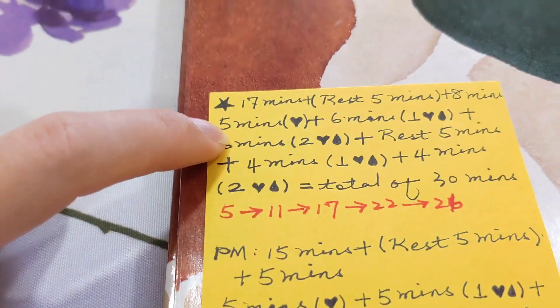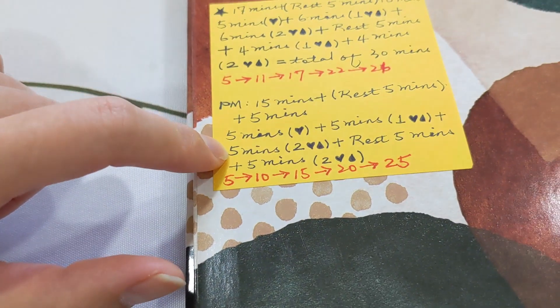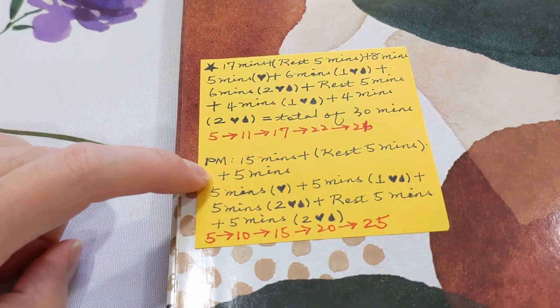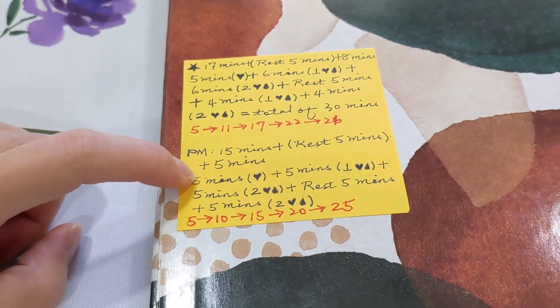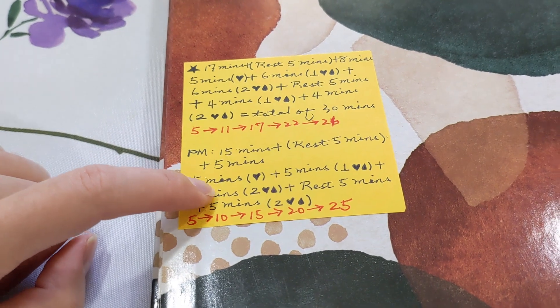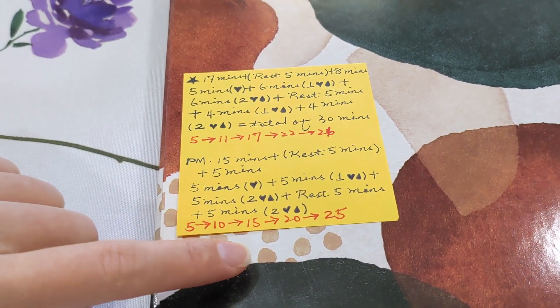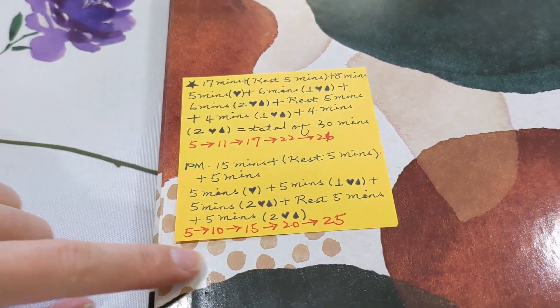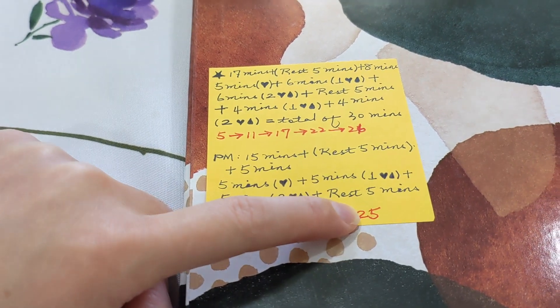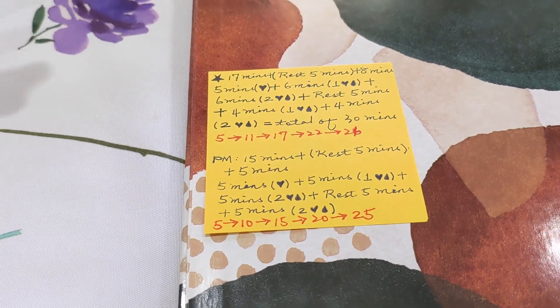In the afternoon I have a shorter 25-minute schedule. I do five minutes of stimulation, five minutes of level-one mixed mode, five minutes of level-two mixed mode, then rest for five minutes, then five minutes of level two. At the 25-minute mark you have to press the power button to turn it off, otherwise it will keep going until it hits the 30-minute automatic shutoff.